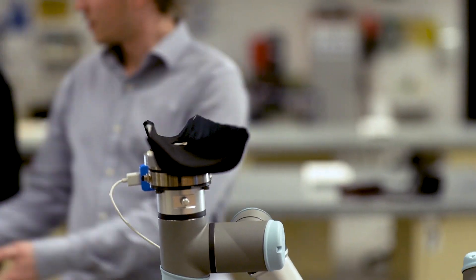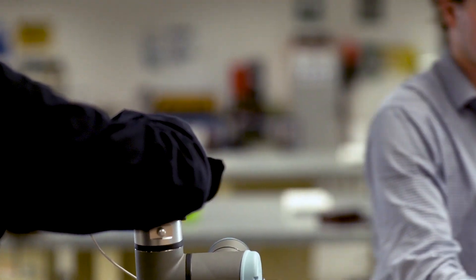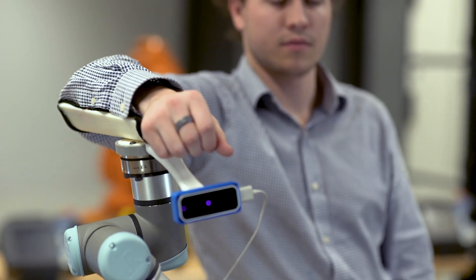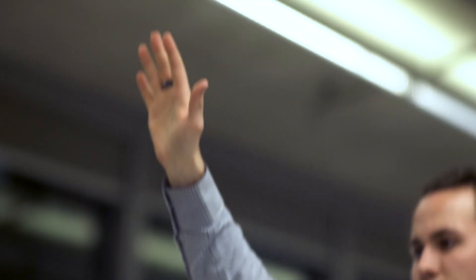So what Techgym is doing is aiming to detach the physiotherapist from the patient. What we do is we put the patient's arm into the cast on the robot. The robot can be controlled by the physiotherapist or it can be controlled by the game. For the physiotherapist to control the robot, they move their hand in front of the camera. The patient will attempt to follow them and when they can't, the robot will move with them.